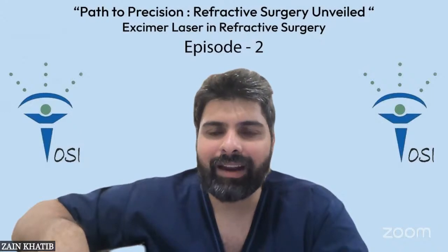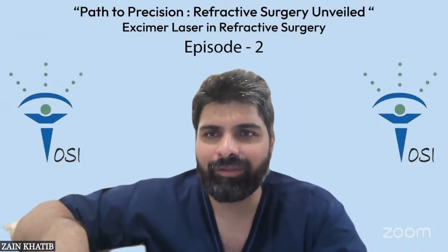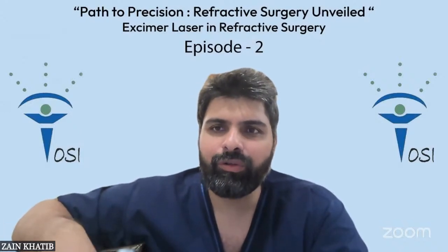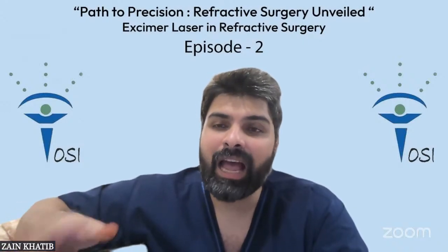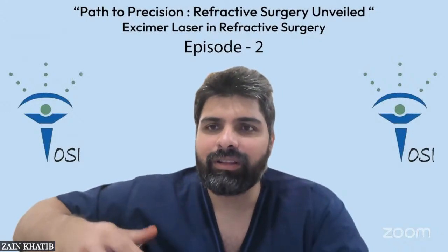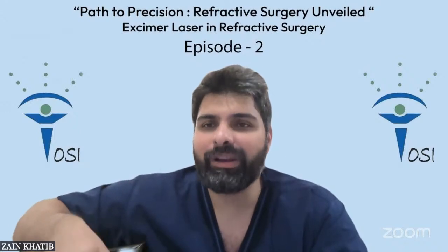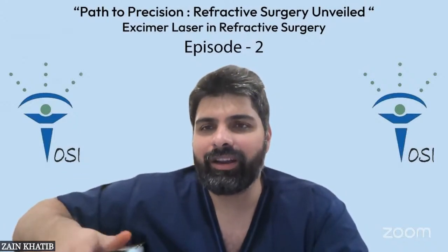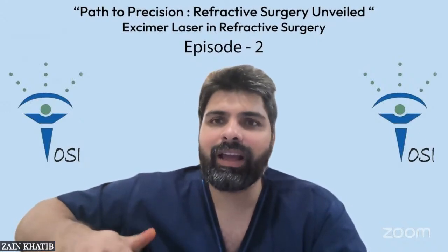As she showed, you let the patient go out and have a walk with that monovision correction. So whatever procedure you're going to do, you are going to induce a little spherical aberration to get better depth. But if they are happy with that initial monovision tolerance test, that really gives you a very good positive indication that this patient will be happy. And then the higher the refractive error, the more spherical aberration is getting induced. So you are definitely adding on to whatever they are getting from monovision.